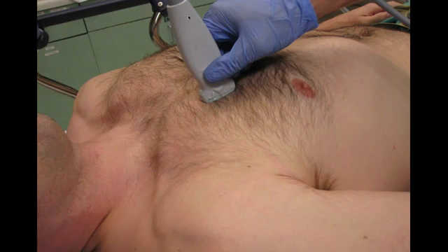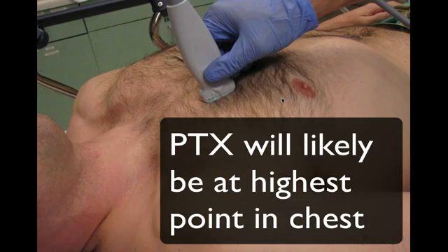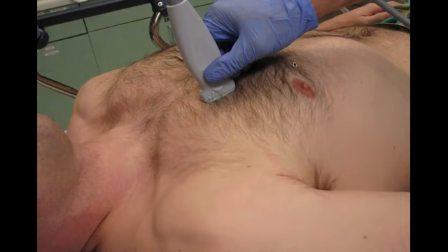The other thing you want to keep in mind is the air is going to be lurking in the place that's the most high in altitude on the chest. So with somebody sitting supine like this or lying supine, it'll probably be located around here where this guy's chest has got the highest peak, whereas if he's sitting up a little bit, it'd probably be more towards the apex. And that should be the area of focus for your ultrasound examination because that's going to be the most high yield spot to find a pneumothorax in most cases.